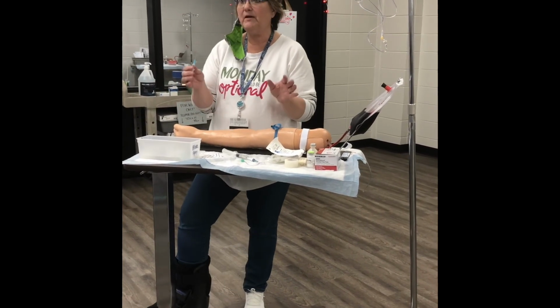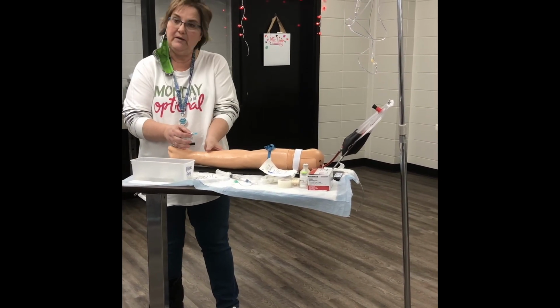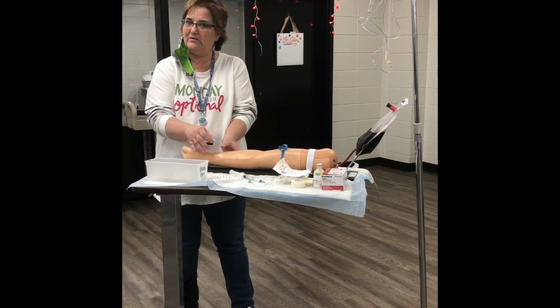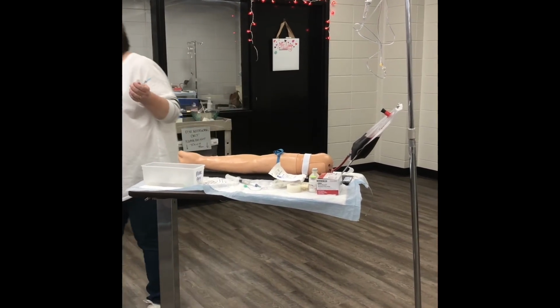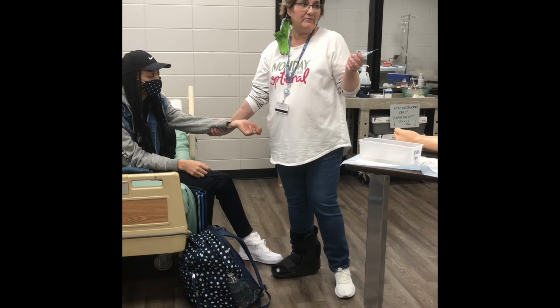So you're going to displace the skin, and you can do that however is comfortable for you. Some people come from here and stick over their thumb. That's fine if you want to do that, no problem. Just don't let it touch your thumb when you're sticking. Some people do it from the side. Lots of nurses will hold it from underneath. That has two purposes: then you can't jerk your arm out when I'm trying to stick you as well.